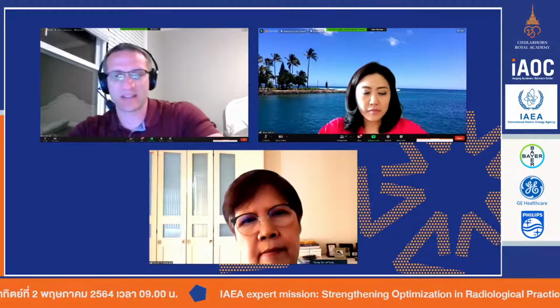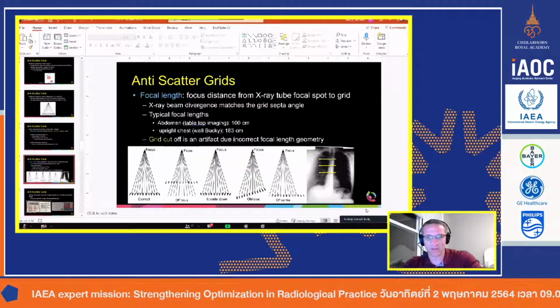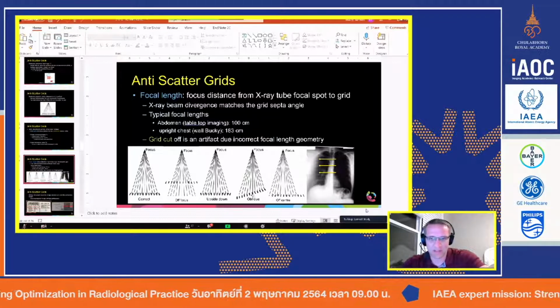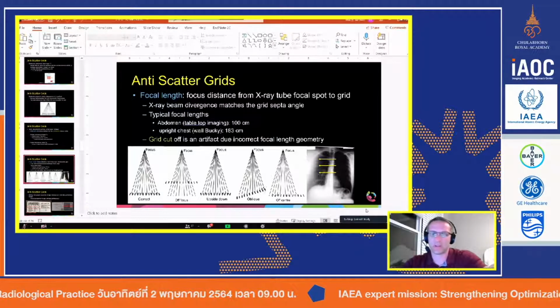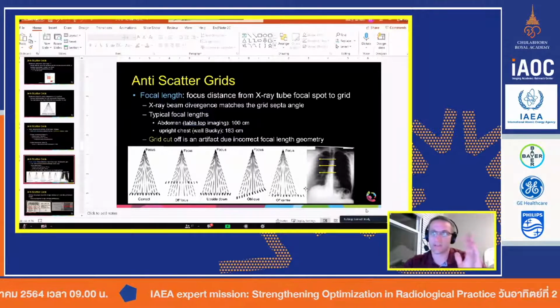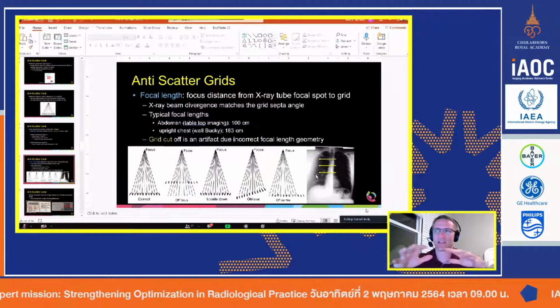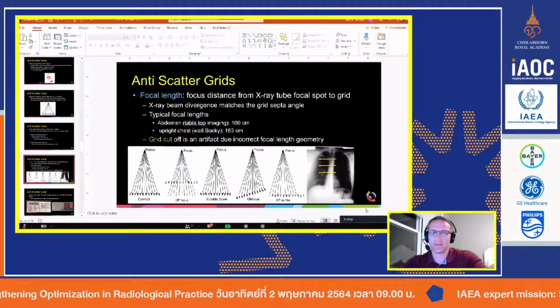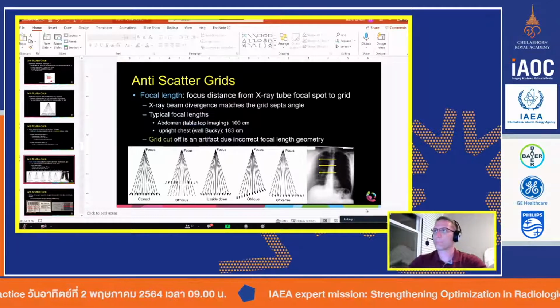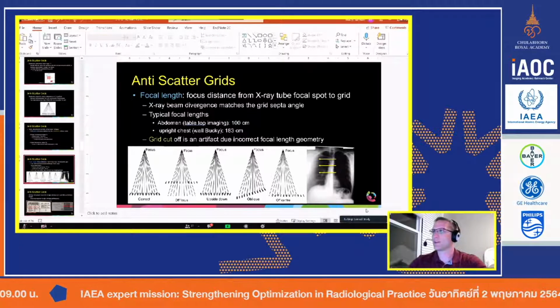What he's basically asking is, in this example right here, the detector is off angle, not the tube. But now if you take the table, but you make the tube off angle, you get this effect. For small angles, it will probably not be too bad. But for large angles, it will cut off. If you're doing film, and some people are still doing film, it will show this a lot more than digital. With digital, like I said, you can adjust to fix that. So yes, do your best to keep the beam perpendicular to the detector. I hope that answers his question.